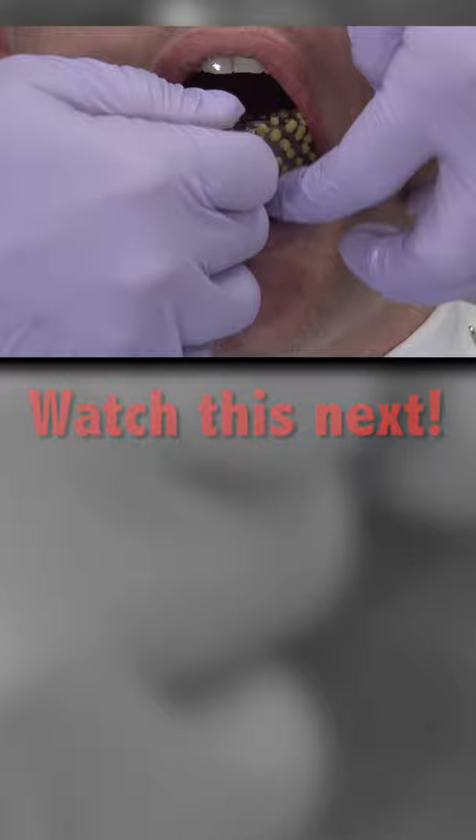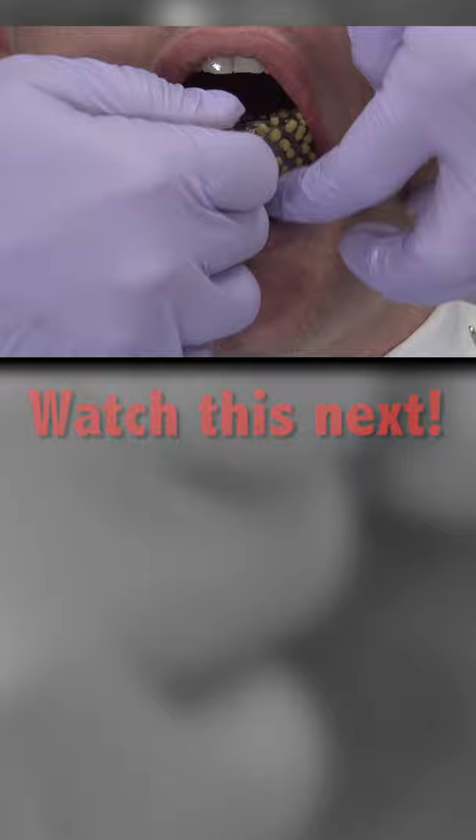Fit the tray back into the mouth and seat into place. At this stage, hold the tray in place with finger pressure and never by asking the patient to bite on cotton rolls or anything else.